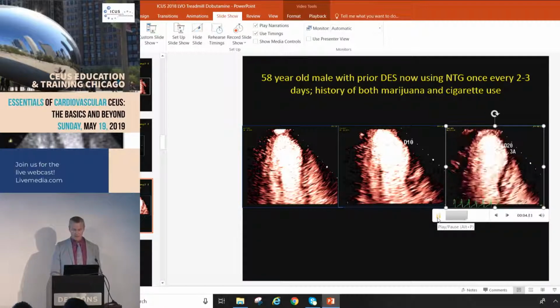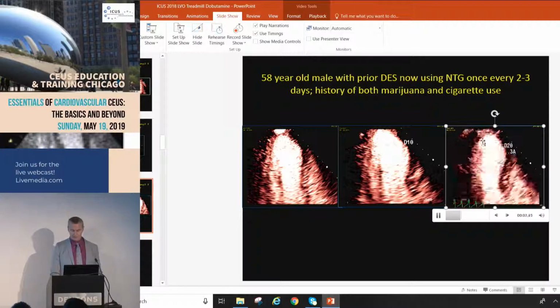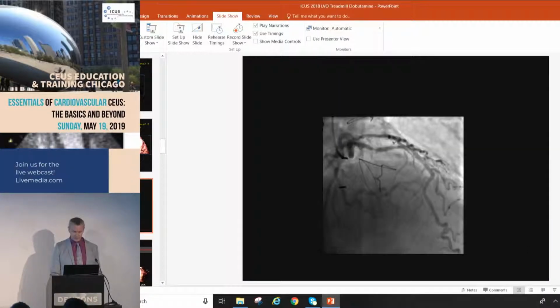And there's the rest, and here again it looked like to us the basal, a little bit inferolateral, was doing okay, but then this whole apex and distal anteroseptal, distal septal, mid anteroseptal was hypokinetic. And then when we looked, he did go to angio because of the extent of the abnormality there. And you can see this LAD lesion was here, kind of in the proximal territory, right here.